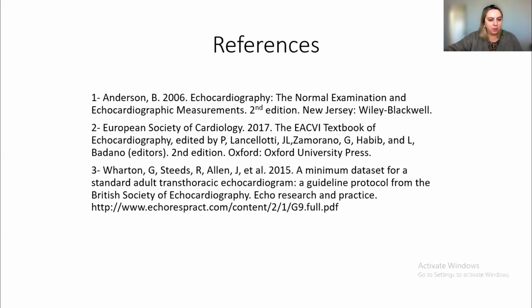And Dr. Imam, do you want to comment on the correct answer? Very nice, very nice. This is the parasternal short axis view at the level of the mitral valve. 90% got it right from my lecture. This is the parasternal short axis view. Thank you. Great. Okay, moving on to the second question.